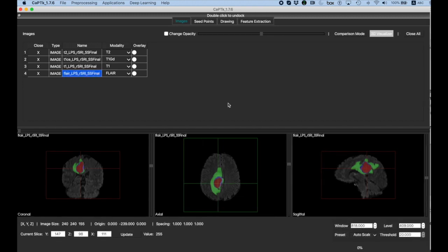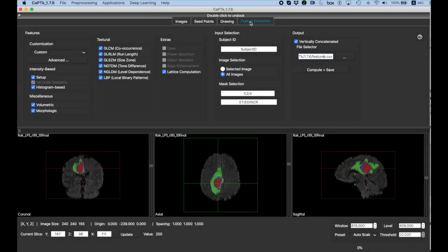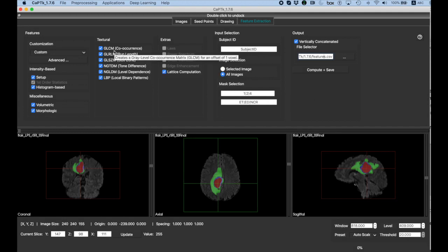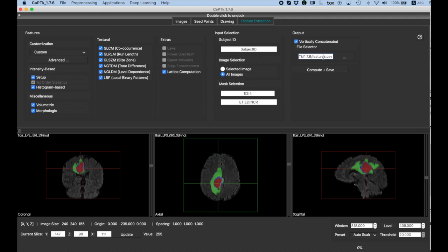Now that we have the tumor segmentation, we can extract radiomic features on any of these regions. To do this, we're going to the feature extraction tab, and here you can select one image or all images and any of the regions of interest. And here you can select the features that you'd like to extract, and the output file goes here. And if you click compute and save, it will write a CSV file that you can use in your machine learning algorithm.